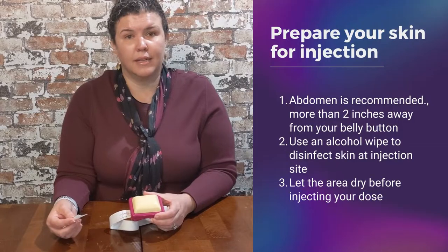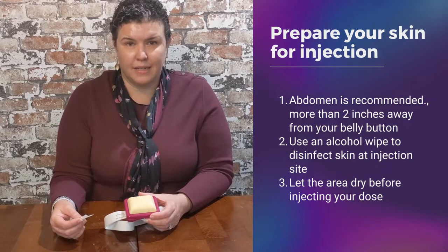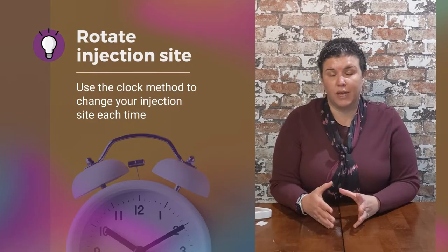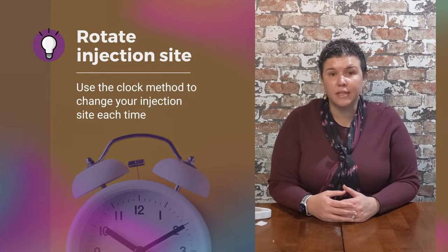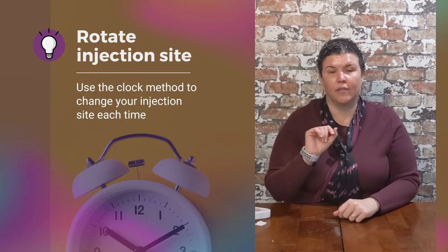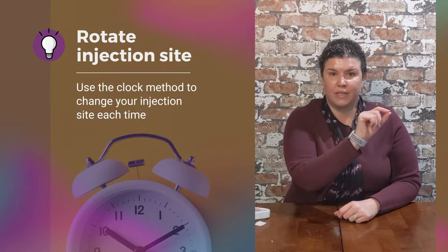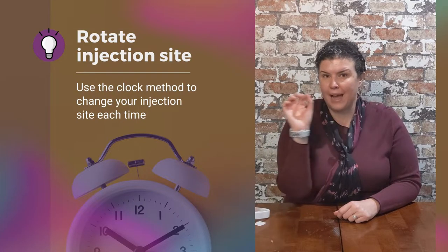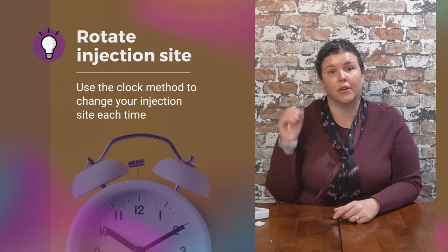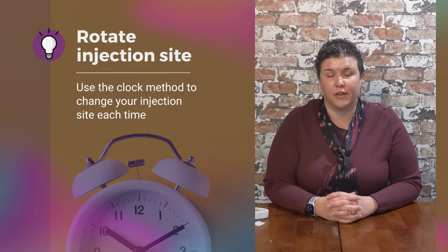It's very important to let the alcohol dry — this ensures less pain and proper aseptic technique. You always want to rotate your injection sites. I tell my patients to think of each side of their abdomen as a clock. After each injection, whether it is day to day or week to week, you go from side to side. But when you go back to that side, you pick a different number on the clock. This ensures that you never inject at the same point every single time and create scar tissue underneath that injection site.